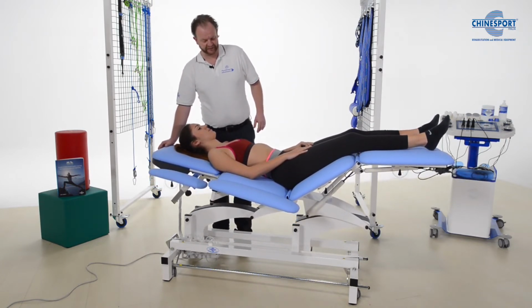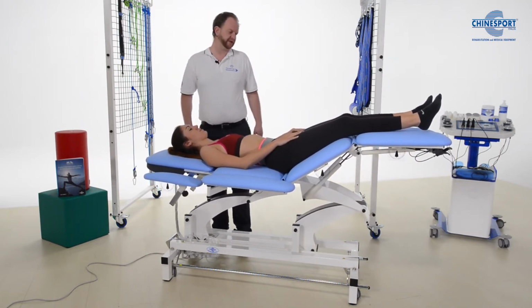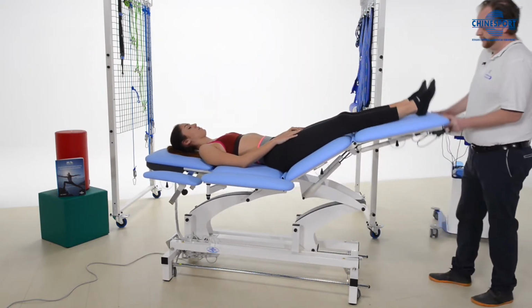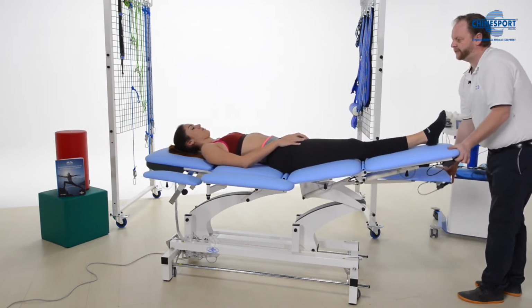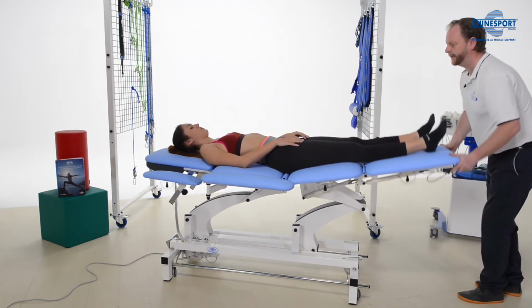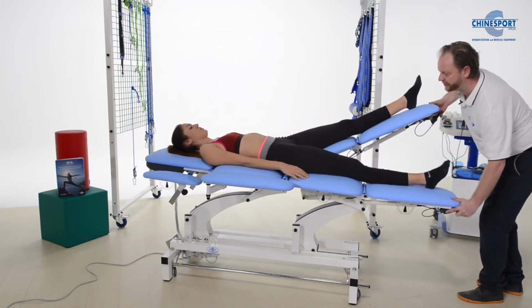After relaxing the patient in this way and doing some stretching, we could go into mobilizations. And we can simply go here, work here, do some mobilizations of the spine. We can go lower, have some higher range of motion, and see when the patient starts having problems.